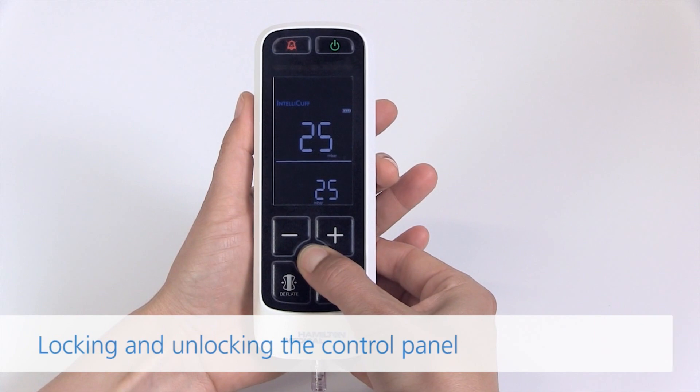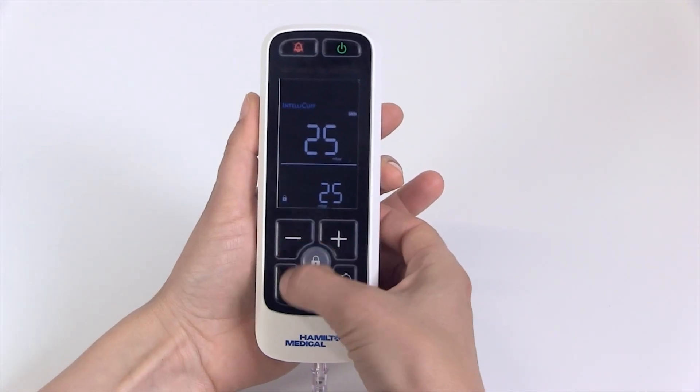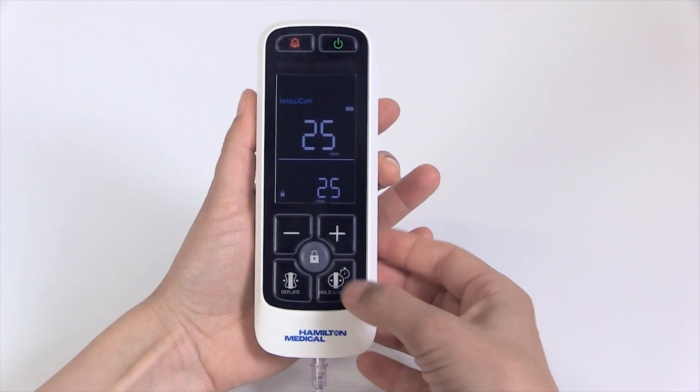Locking and unlocking the control panel. Long press the lock button. All buttons are disabled except for the alarm silence button.